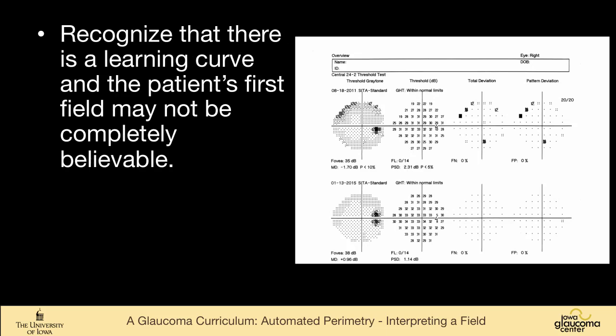Recognize first that there's a learning curve and the patient's first field may not be completely reliable or believable. This is a subtle example. You can see the top field here has a little bit of scattered defects in both the total and the pattern deviation here. The hemifield test is not fooled. It thinks this is a normal field. But when you repeat the field, you can see that the performance is much better and the quality of the field is excellent, completely normal.